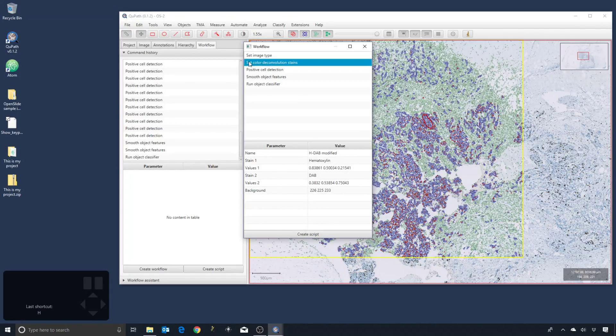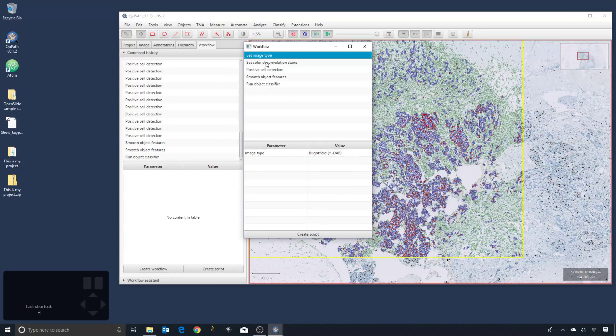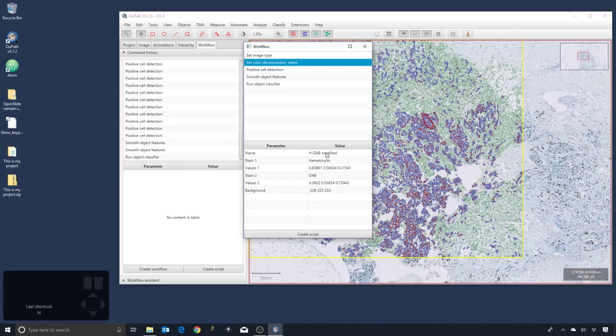I do want to check that what is logged here is the modified color deconvolution stains. But because we named them, that information is there. So I can see it set the image type, it set the stains properly, we run the positive cell detection, we smooth the measurements, and then we run a classifier. So I can create a script then.